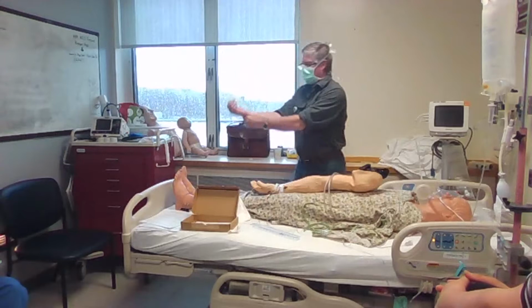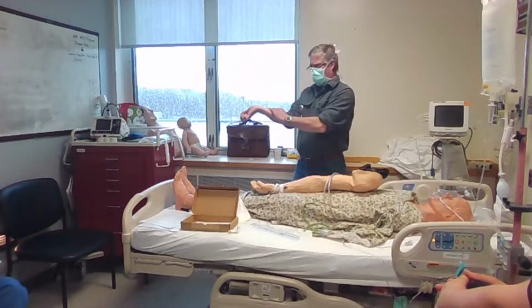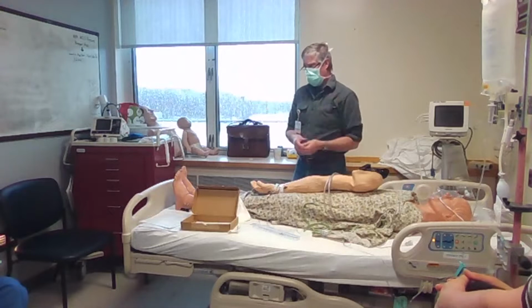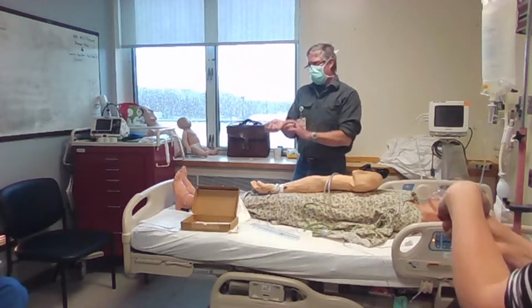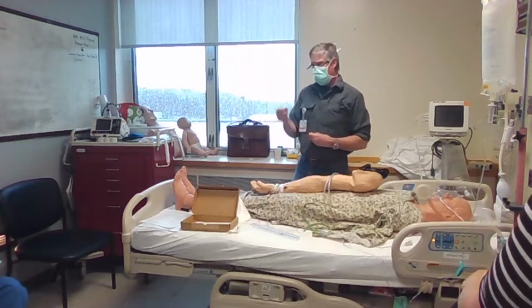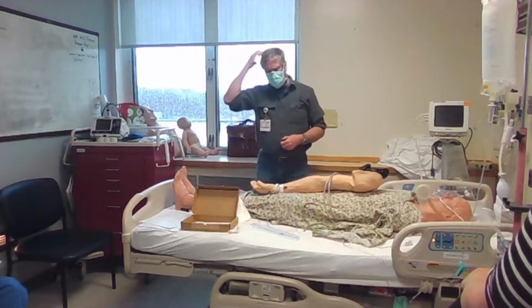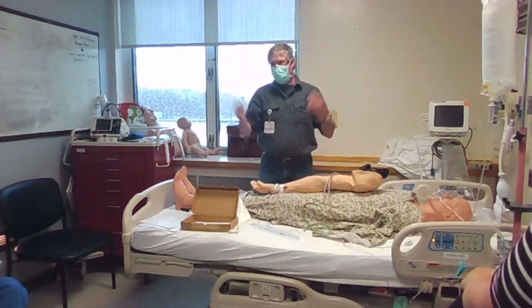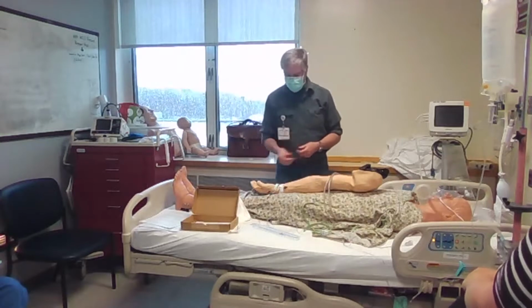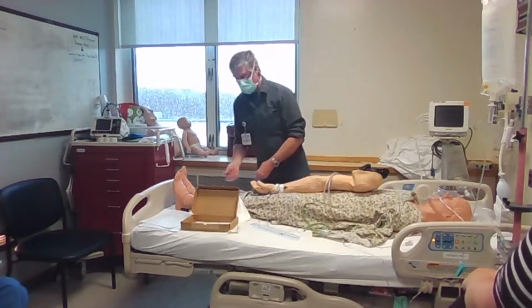And what that does is bring the wrist up to you, which makes it easier for you to get access, and it makes the skin more tense. Like, as you know, starting an IV, we pull the skin, we put the needle in. It's the same thing here. You pull the skin, and you're trying to get a needle with a catheter on it. So it goes through the skin really hard sometimes, especially people who are in the sun a lot or like farmers. And then when you tape it, you put that little piece underneath it.